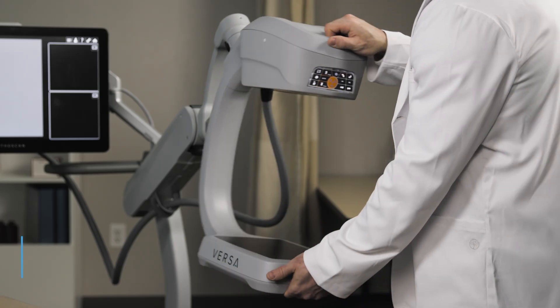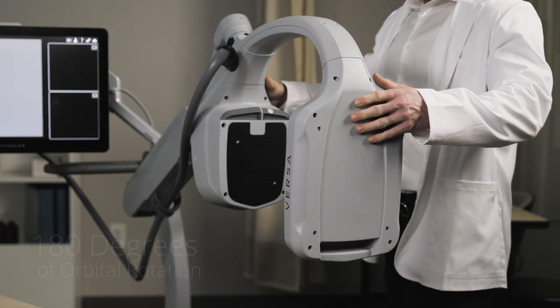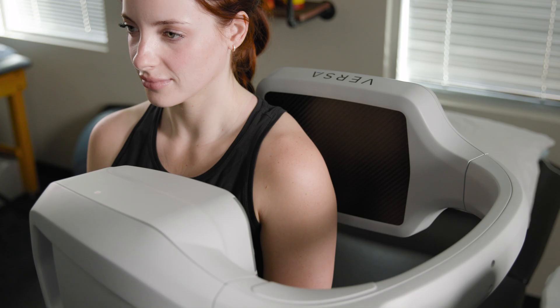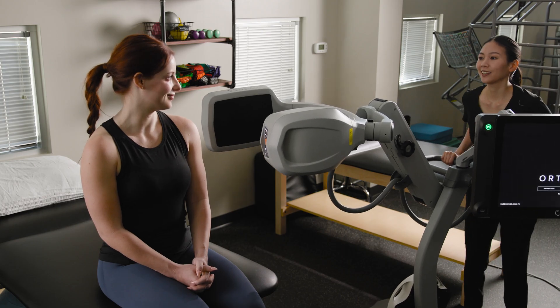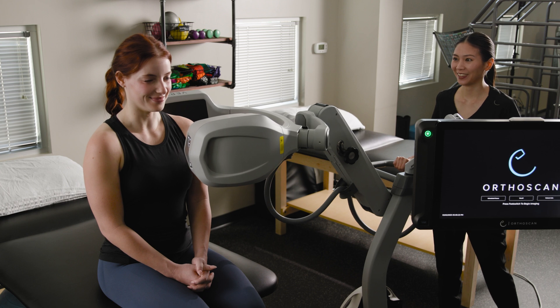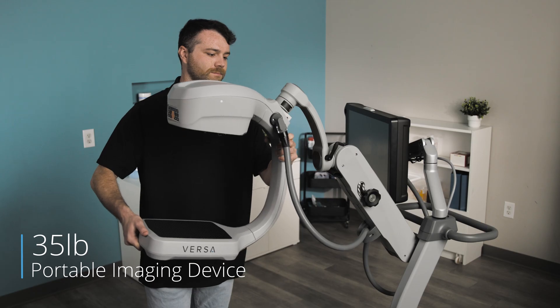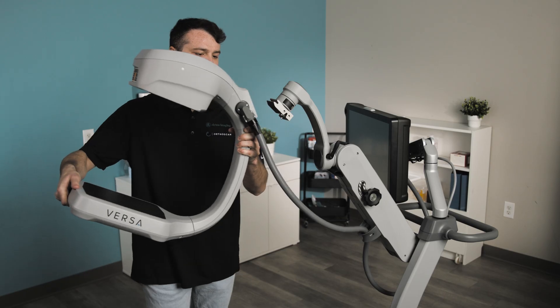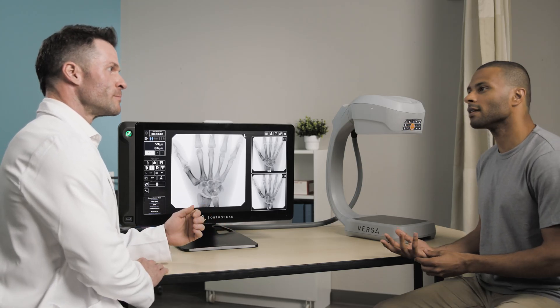The Versa Mini C-Arm features an impressive 180-degree orbital rotation, allowing for optimal imaging of the knees, shoulders, and additional extremities. This over-rotation capability provides preferred anatomical views without unnecessary stress on the patient. Weighing just 35 pounds, Versa functions as either a fully portable system or a desktop workstation, adapting to diverse clinical needs.